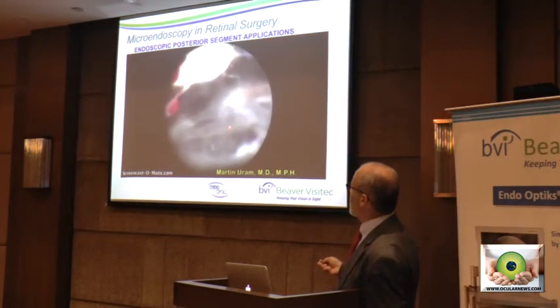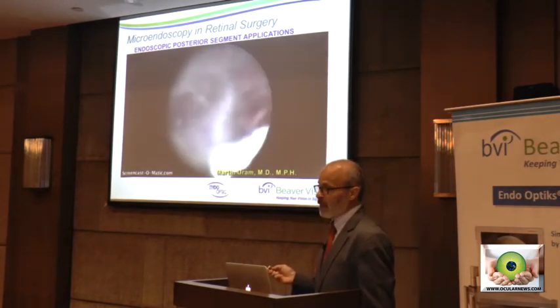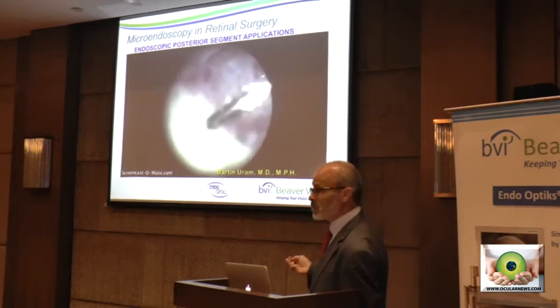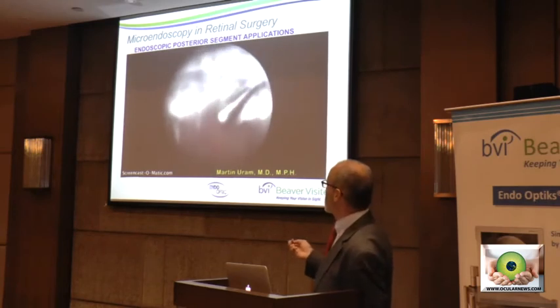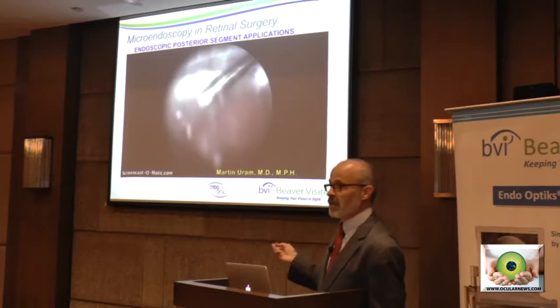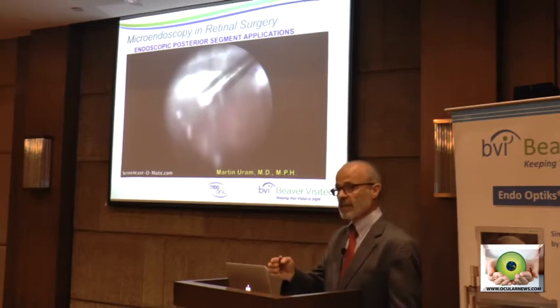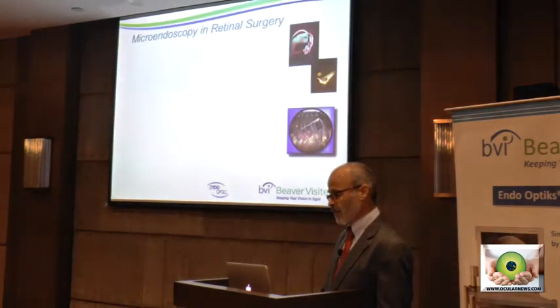There was a case study just done by Jeff Heier in Boston and by Dr. Boucher at the American Hospital in Paris, showing success rates of 60 to 65% saves in these patients who generally have a very poor prognosis, in cases of severe recurrent endophthalmitis. Many of these patients have patent retina underneath and they get in early before necrosis starts. And this is a very nice indication for the endoscope.